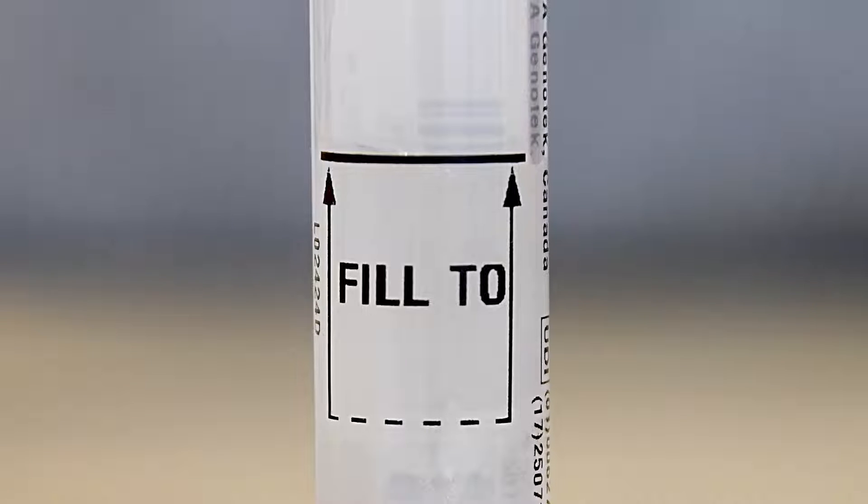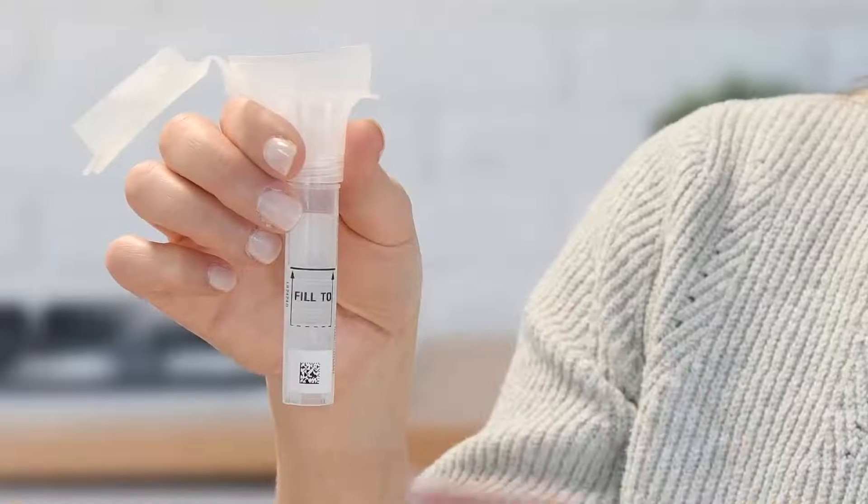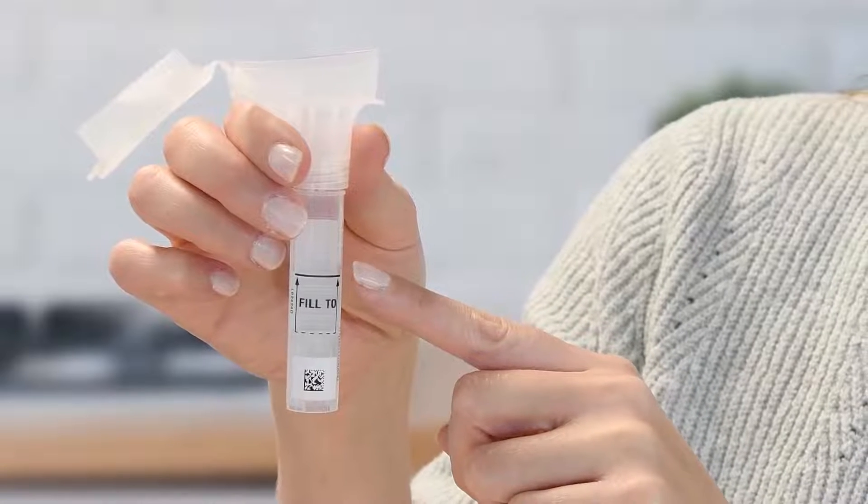Be sure that you spit enough liquid saliva, not including bubbles, to reach the fill line. You will find the fill line on the label on the side of the tube.